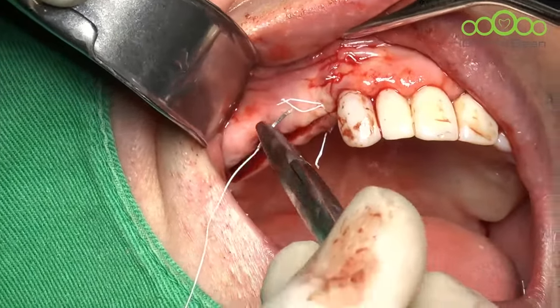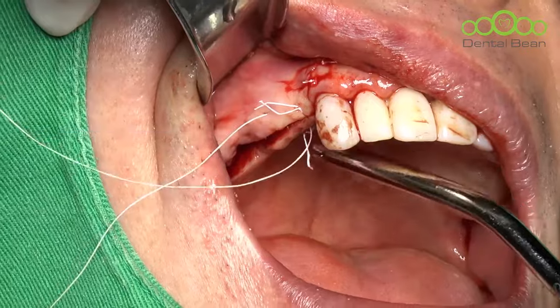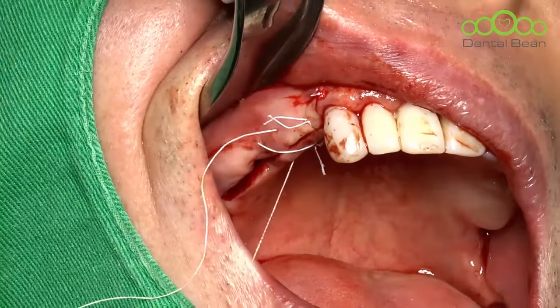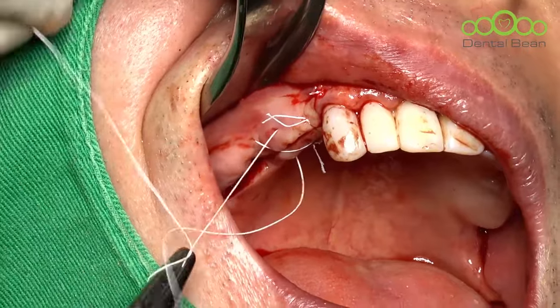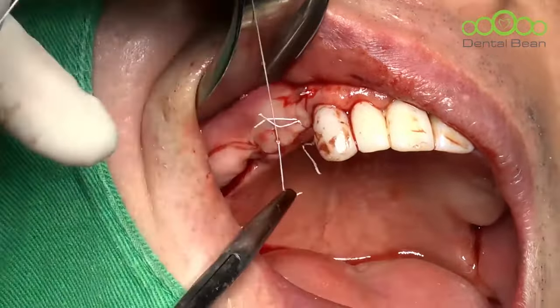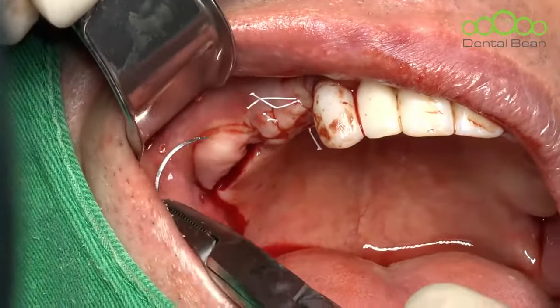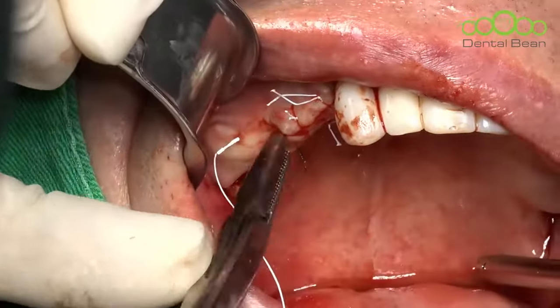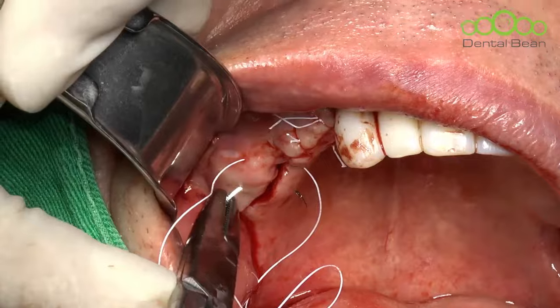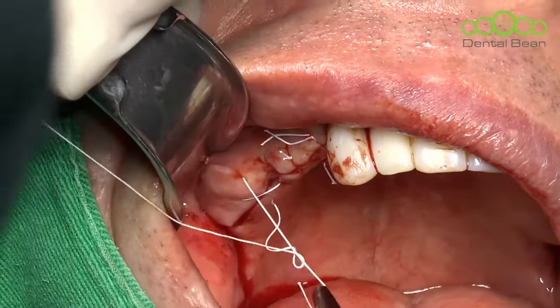Okay. Yeah, I'll continue the suture. Hold. At the crest, usually I like to use a cross mattress suture to speed up. To speed up, I prefer this cross mattress suture. The advantage of this suture material is that it is clean, easy to make a knot, and there is less pricking. The patient feels comfortable during the maintenance. But the disadvantage is that it is sometimes difficult to control. If you have a poor needle holder, it slips easily, and one more disadvantage is cost. It is expensive. But to make the patient comfortable, it is better to use such a good material.